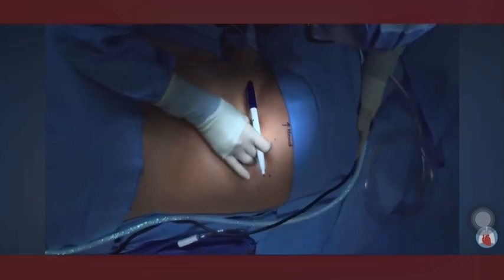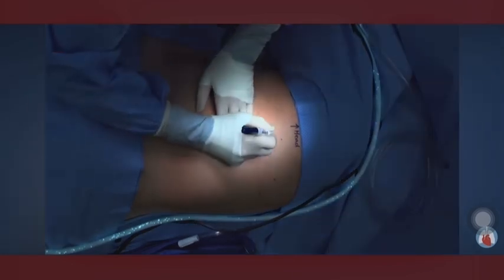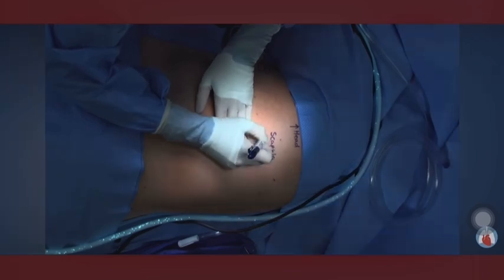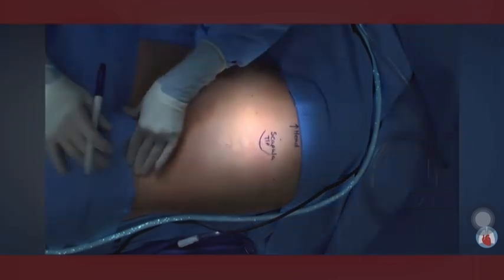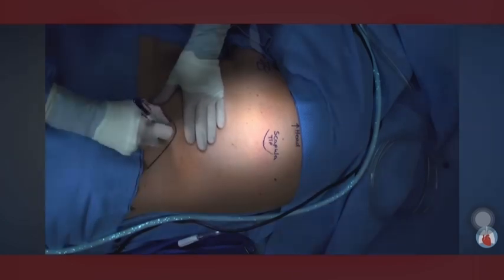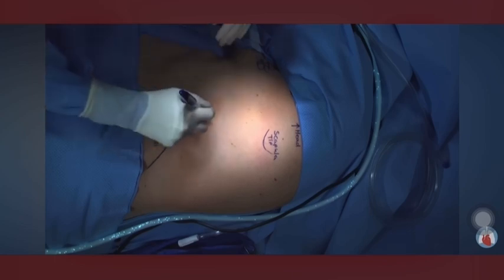It is always important to identify your landmarks, even in an emergency situation, because you want the tube to go in quickly and into the right place. This time up front is well spent and saves the time and the effort of a poorly placed tube. We start by identifying the tip of the scapula. This can be accomplished by pushing down on the shoulder to gently move the scapula against your finger. Mark that spot.